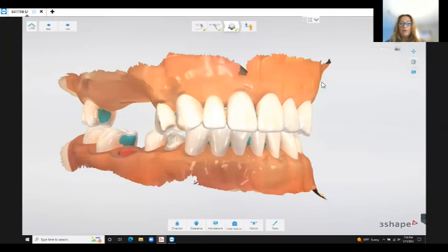Yeah, so after the patient has healed somewhat, immediate dentures become really loose, right? So as you put your chairside reline in, and that's why I was saying earlier, if you have a good chairside reline in an immediate denture and the patient has good suction, especially on an upper, go ahead and scan that chairside reline inside of that immediate denture.